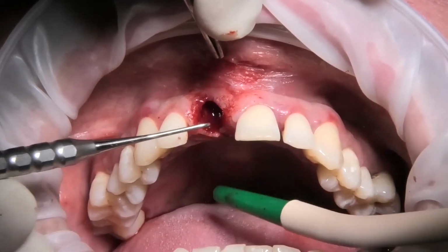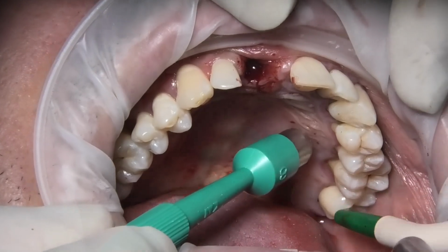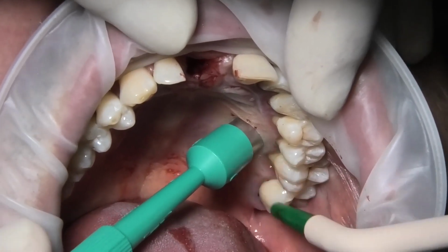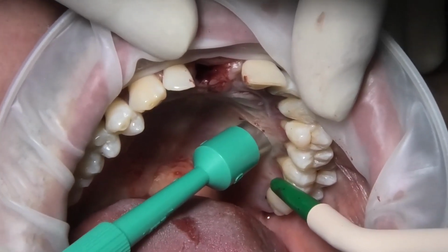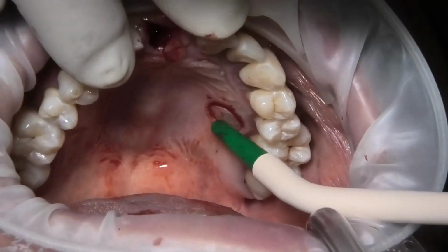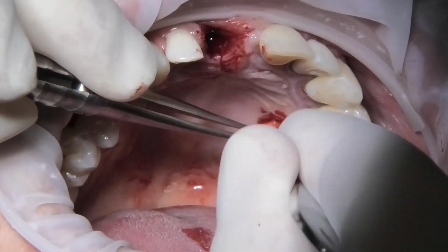At the end of this point, we go to the palate, and with a circular mucotome-type scalpel of 8 mm of diameter, we carry out a circular punch of connective epithelium in the area of the second premolar, first molar. So we took an epithelial connective tissue graft. And now we sink the scalpel for about 3-4 millimeters without touching the bone plane underneath. And then with the surgical forceps and the standard scalpel, we take the palatal punch. We remove the punch.